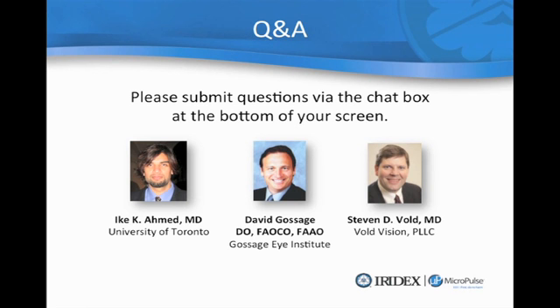I will tell you that my experience with the 532 has been drastically different than the experience that I had with the 810. So I really think the 532 is a little bit different beast than the 810. Thank you. Question now is, what is the biggest risk in MLT, and how do you get comfortable with it? From a risk standpoint, I don't really see any risk for it.